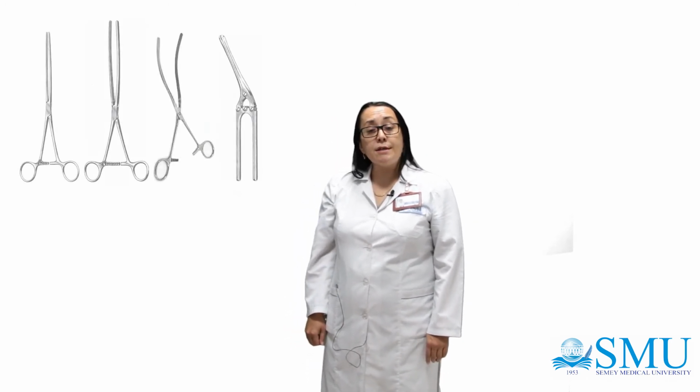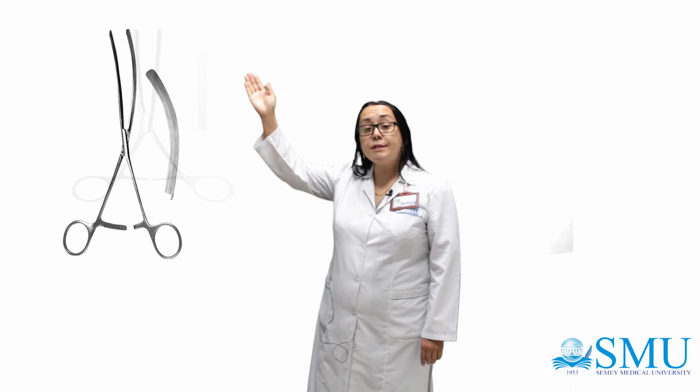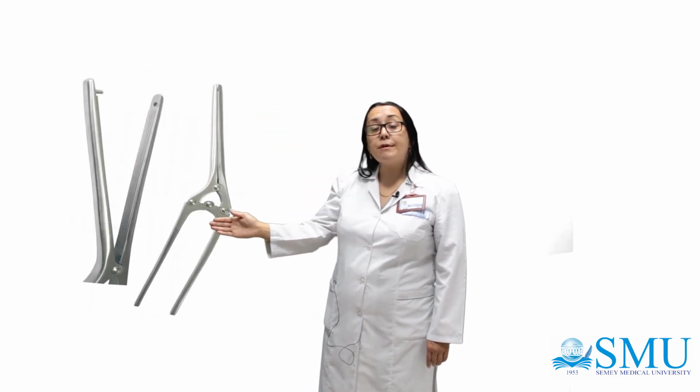And soft elastic clamps used to hold intestinal lumen and prevent the contents of the intestine from pouring out while the intestinal wall is not injured. It's an elastic straight intestinal clamp, elastic curved intestinal clamp, and this is Payr's intestinal crushing clamp.